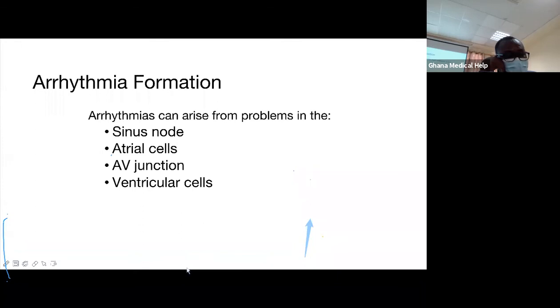The other one that Bismarck asked, which I left out, was the T wave. Let me bring that in so that it becomes complete, which is for the ventricular repolarization.